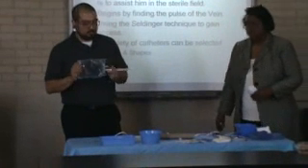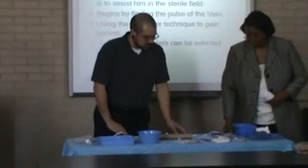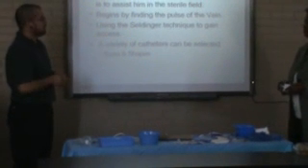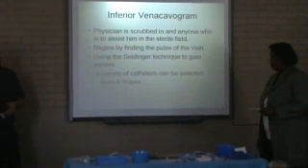Throughout the exam, everything is flushed out with heparin, so that the patient wouldn't clot and cause an embolism that would run through the body and cause clotting.